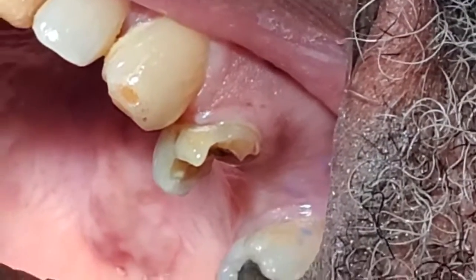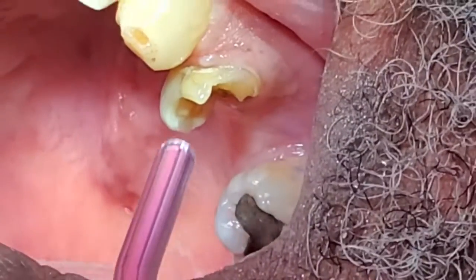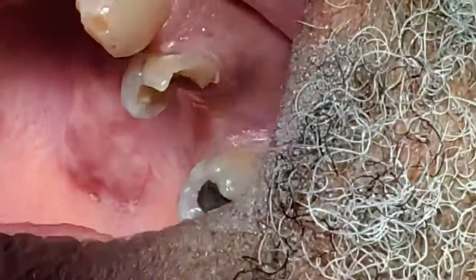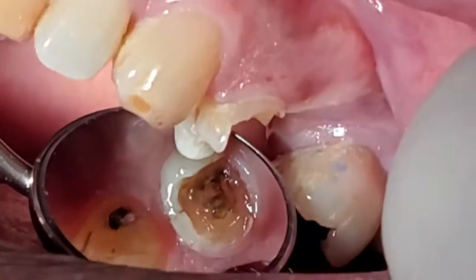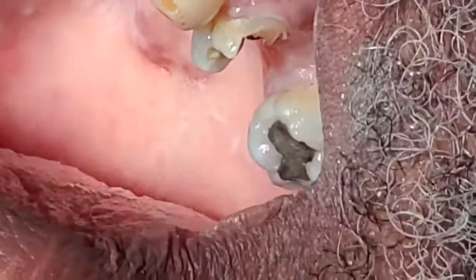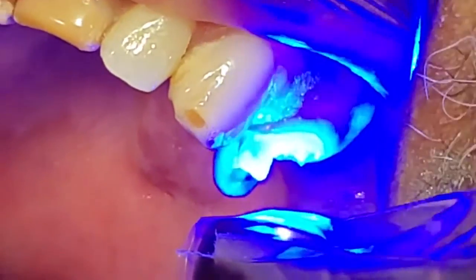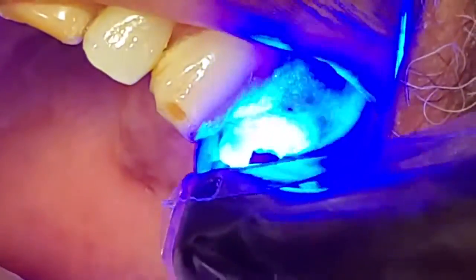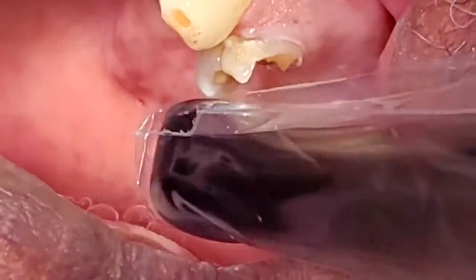Once you've done this for about 20 seconds, we're then going to lightly air dry. We have an air syringe on our assistant side and we're going to start further away just to blow off the monomer, then get closer and air dry. When we air dry we should see a shiny tooth — like you can see there, it's shiny, telling you your adhesive is in place. Then we're going to take our Velo light and light cure this, rotating the angle so we're curing all sides. The Velo we're using has a 12mm head so I know I'm encompassing the entire tooth.